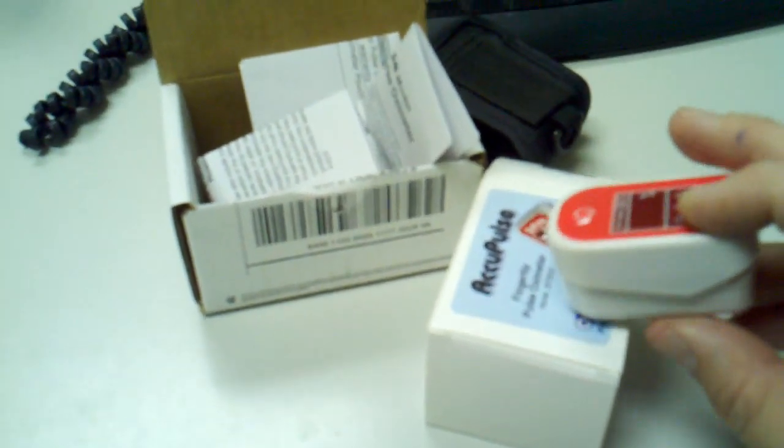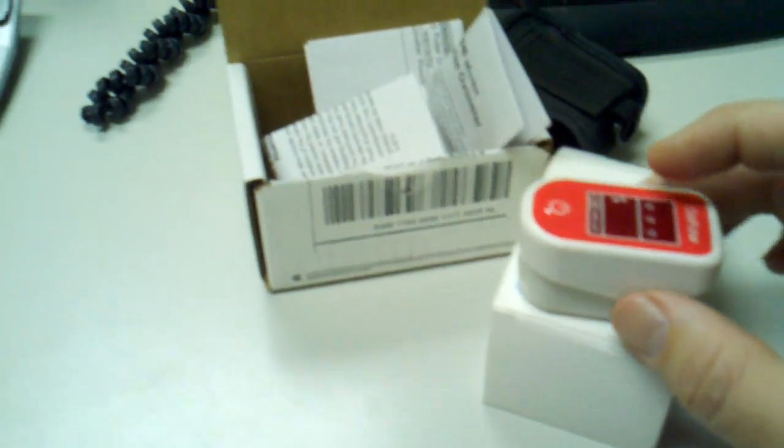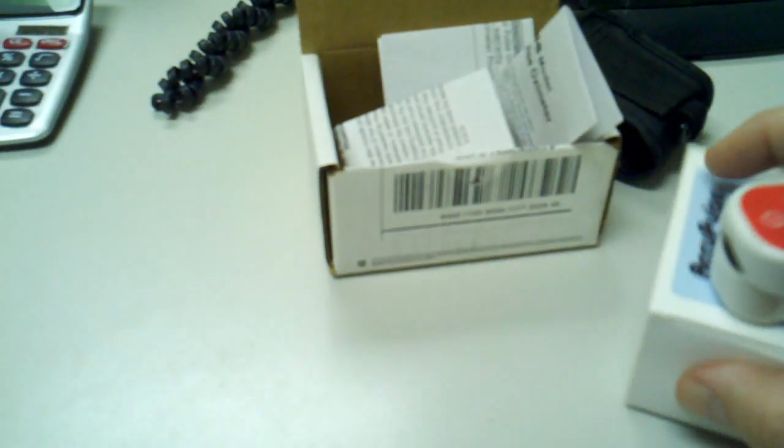When you order from GoSouthernMD, it comes in a box like this. This is how it's shipped. Then you take the unit out. This is the other small box that it comes in.